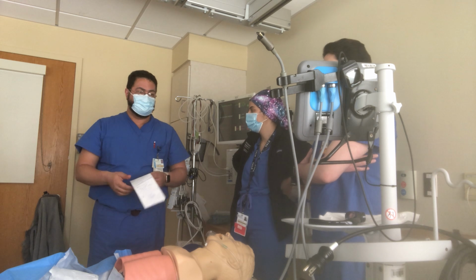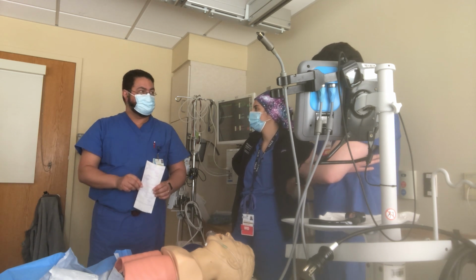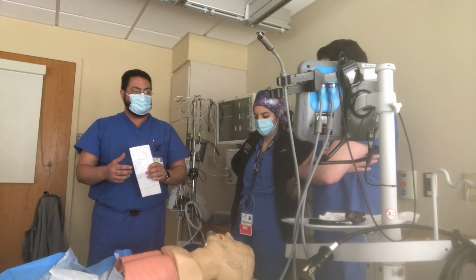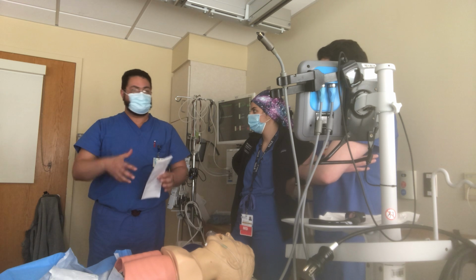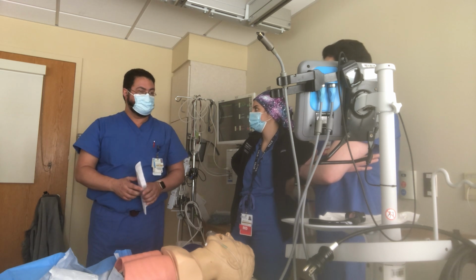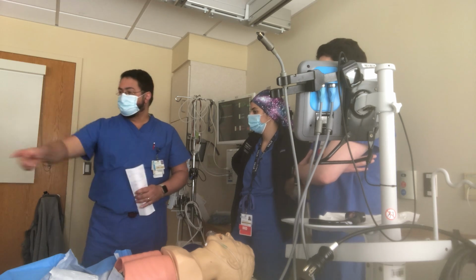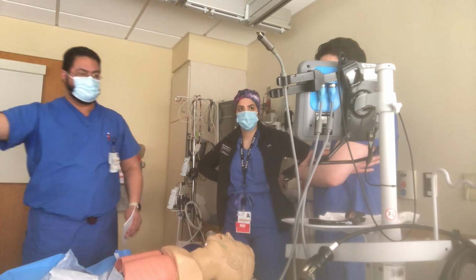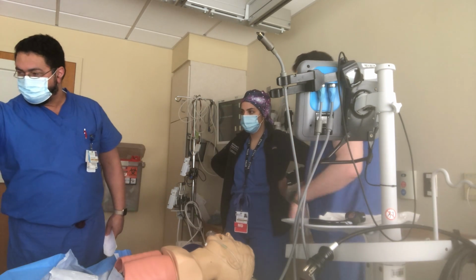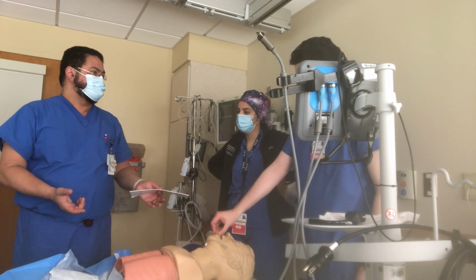And then of course the scenario where we're having can't intubate, can't ventilate, but the patient is not vomiting or doing anything. There's upper airway, just can't ventilate, can't intubate. So what are we gonna do? We're gonna have to start with the intubating LMA, the one that you mentioned. Can I have it from behind you? No, that's LMA. This is LMA only. I removed it from the difficult airway. Where? No, it's okay. Lowest drawer. So intubating LMA is a lifesaver. Lifesaver.